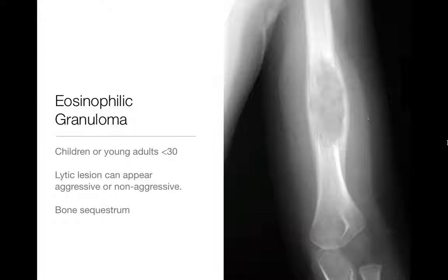Next up, eosinophilic granuloma — only consider this in children or young adults. Please don't think about eosinophilic granuloma in adults only; you're likely to be wrong. It can be single or multiple, and can look very benign or very aggressive. Here's a four-year-old with a geographic lytic lesion with a wide zone of transition and periosteal reaction that looks a little laminated and scary — but it turned out to be eosinophilic granuloma. Classically you'll see a bony sequestrum in skull lesions. Not statistically likely to occur in people over 30 or so.